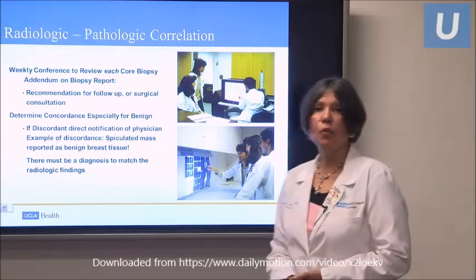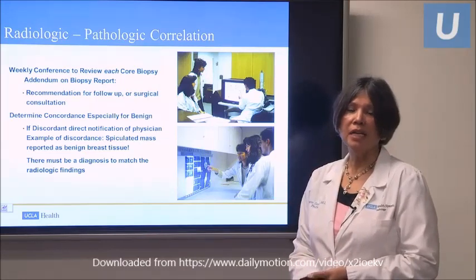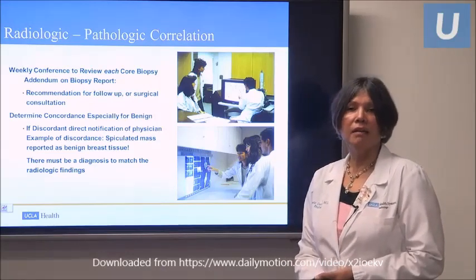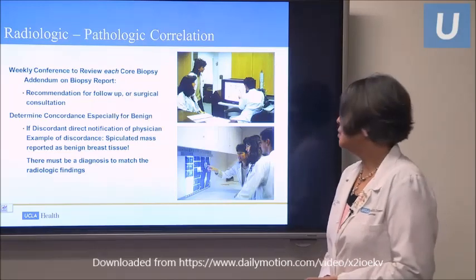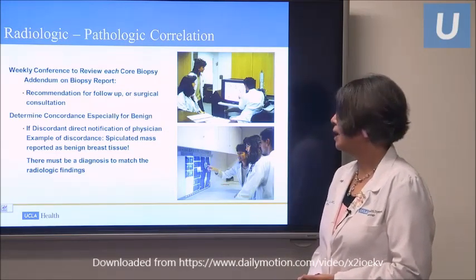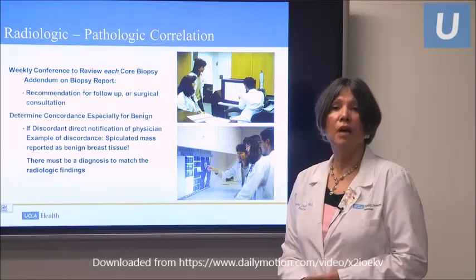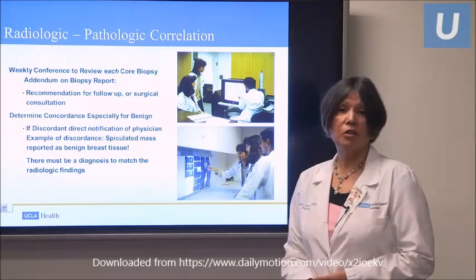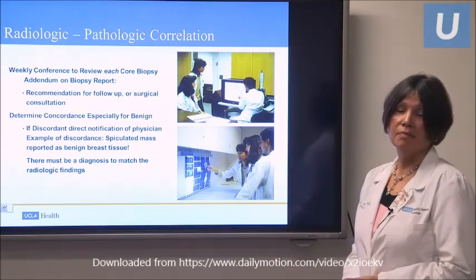From the biopsy, we as the radiologists then actually get together with the pathologists. That usually occurs on a Friday or weekly, and we review all of our biopsy results. And we determine if we think that the imaging findings and the pathology findings are in agreement. That's what we call concordance. If we think there's a disagreement in what we find, then we call it discordant, and we notify the physician, usually the referring physician, and let them know that we think additional procedures or imaging, maybe a repeat biopsy, or surgical intervention is needed. And the diagnosis must match the radiologic findings.